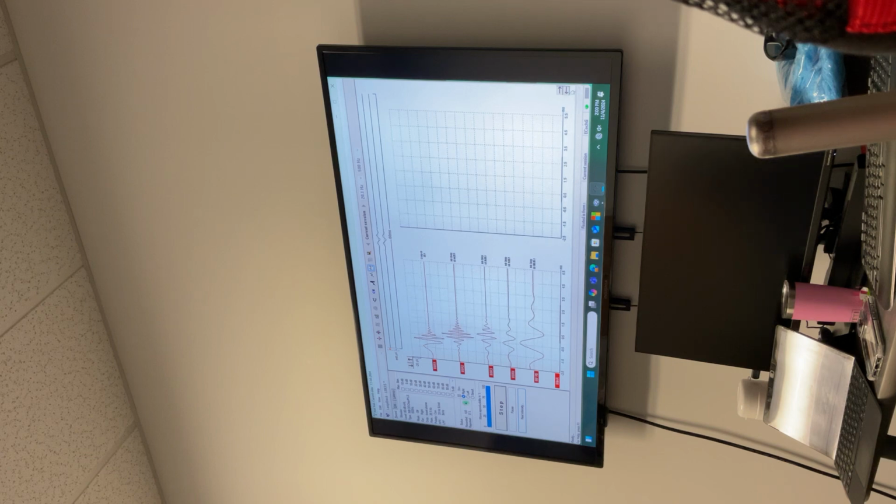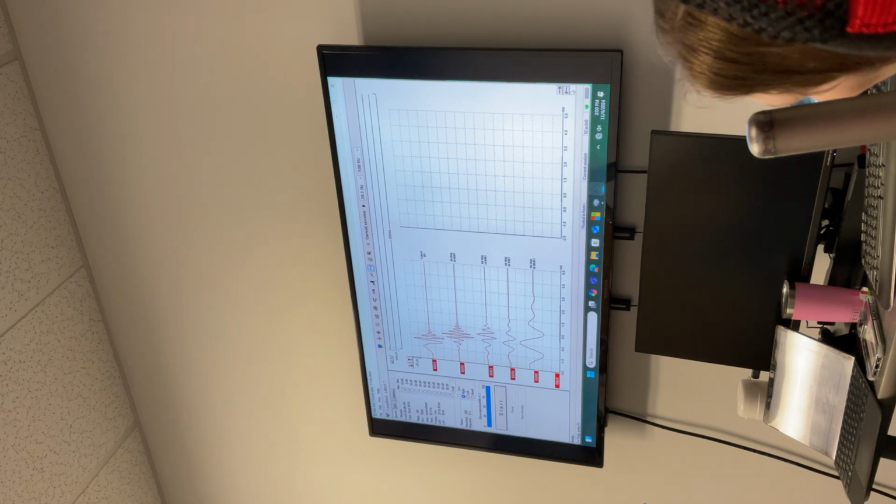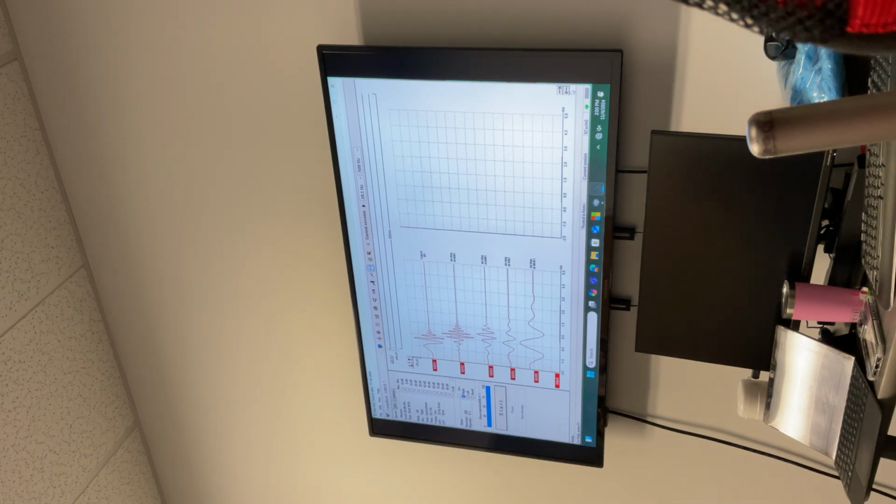So what are the stimuli you see on the screen? From the top, what is the top one? The top waveform is the broadband chirp. The second one is the 4000, the third one is the 2K, 1K, 500. Those are all narrowband chirps, but not the top one.